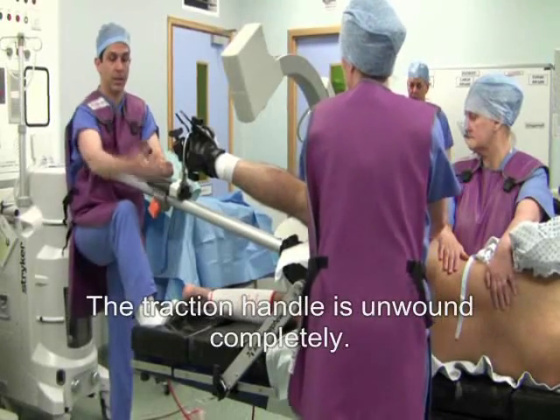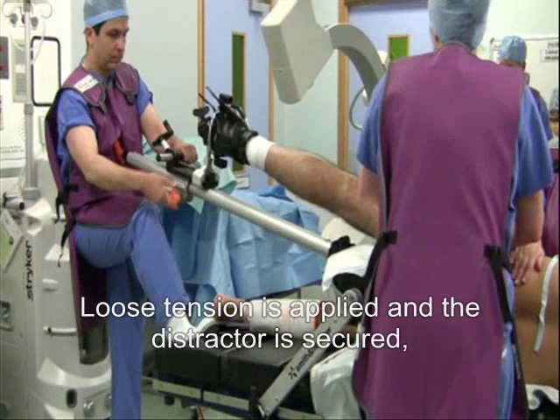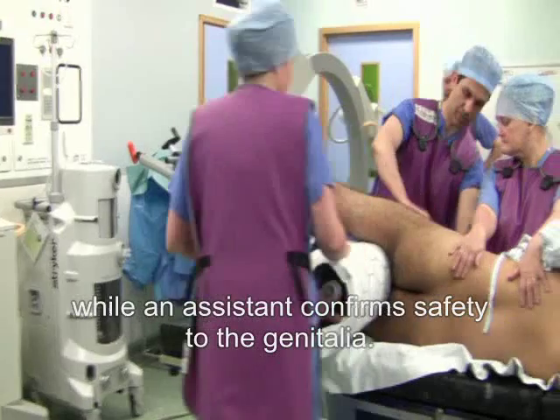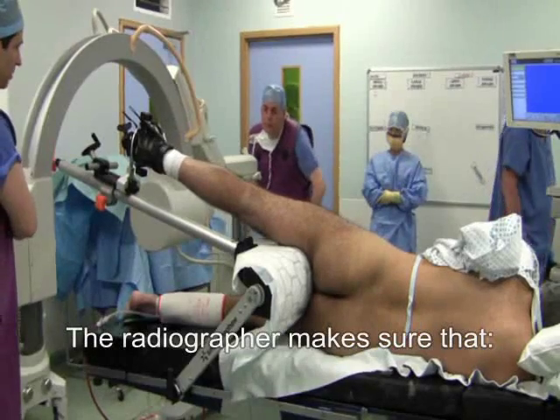The traction handle is unwound completely. Loose tension is applied and the distractor is secured while an assistant confirms safety to the genitalia.